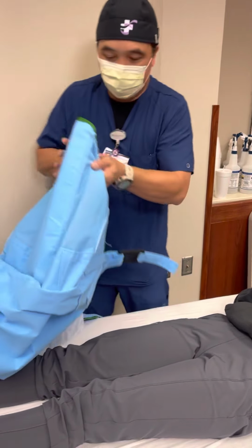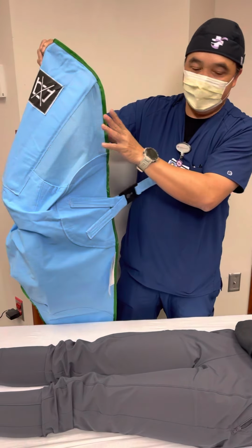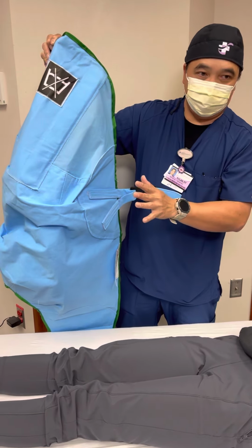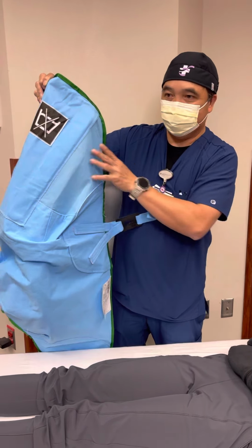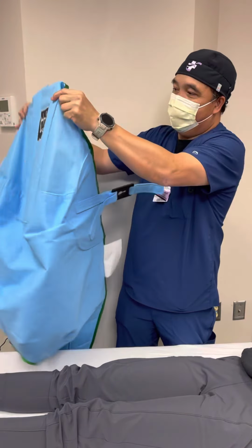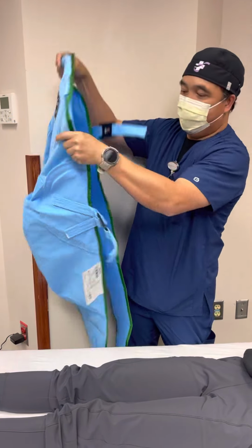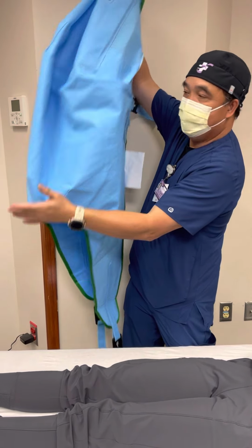So this is the sling, it comes in I think XXL and XL. So if you're not sure, go for the biggest size possible, as too small is worse for a big patient, okay? So this is the outside and this is the inside, and this is where the head of the patient should be. And we have a little cutout right here, and this is where the bottom of the patient should be, okay?